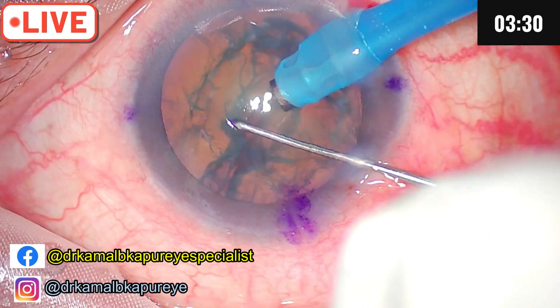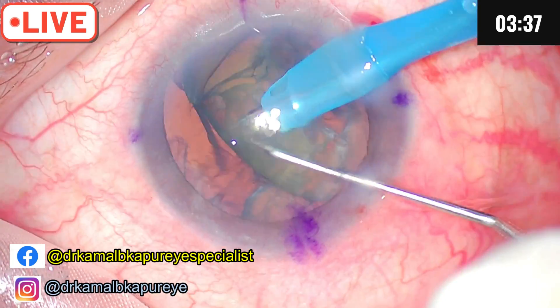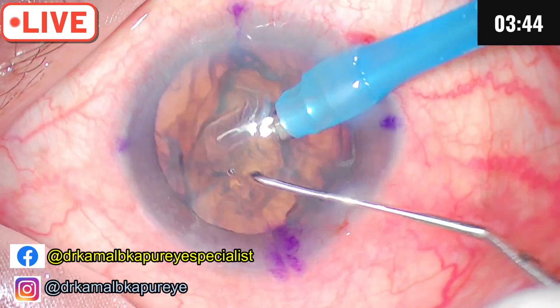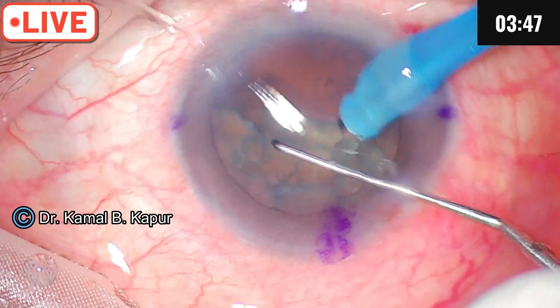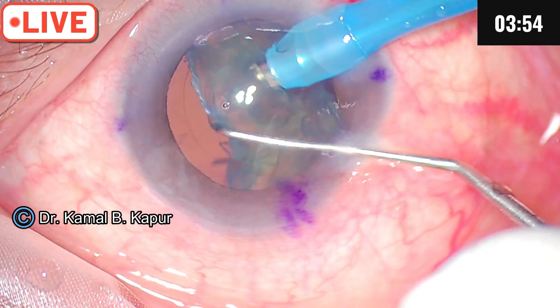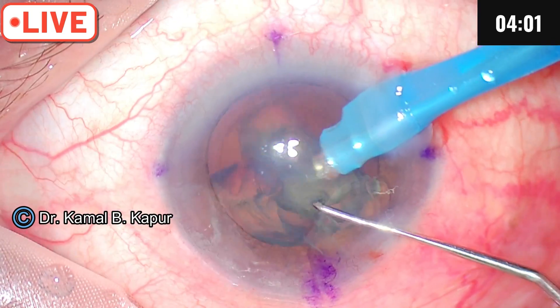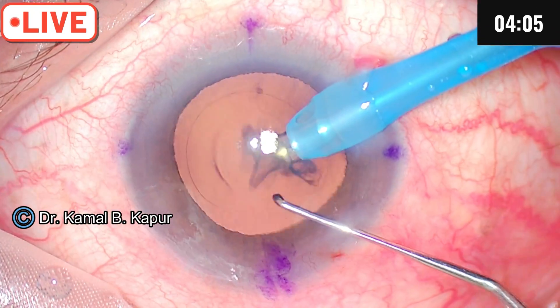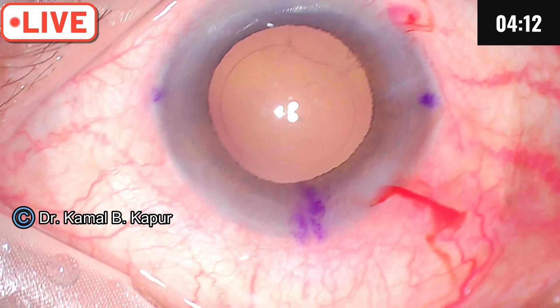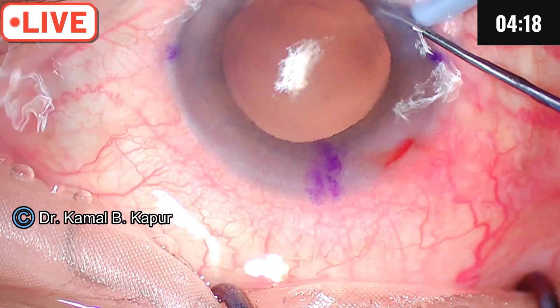Even a very soft cataract can be divided. I'll use the D-flip technique, holding the D-segment at the junction of one-third and two-thirds, then flip it — this avoids the chopping maneuver in the bag and makes it very swift and fast. A similar maneuver is done on the other side. The case is nearly over, and because our hydrodissection was very precise, there is no remaining cortex. No remaining cortex is also a sign of good planar dissection. We will go ahead and wipe off whatever little fibers remain.